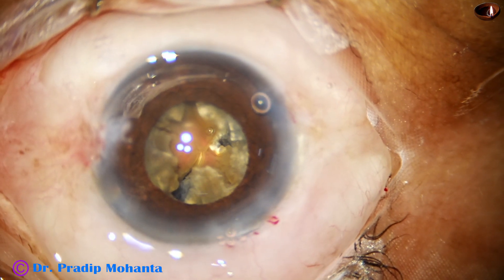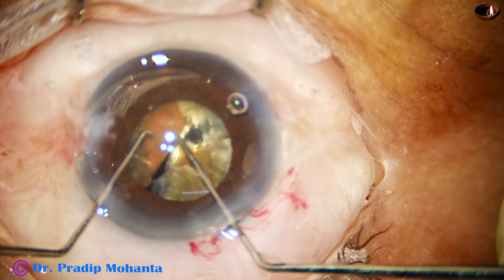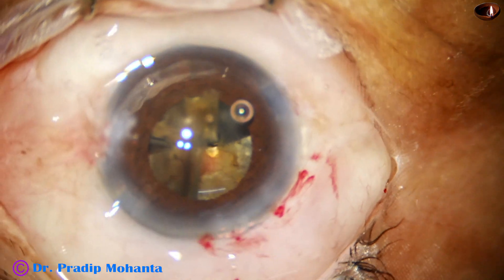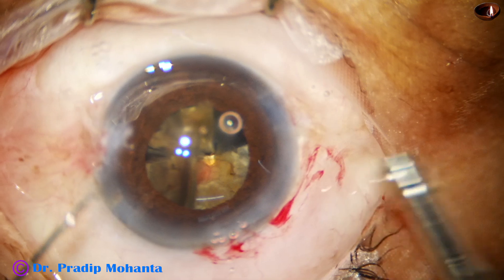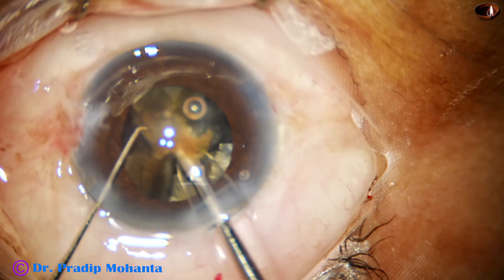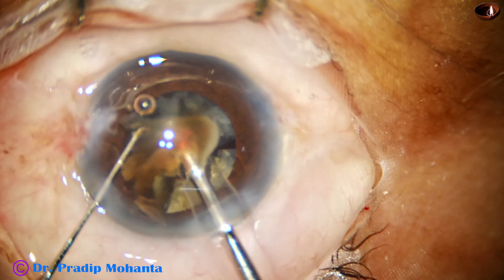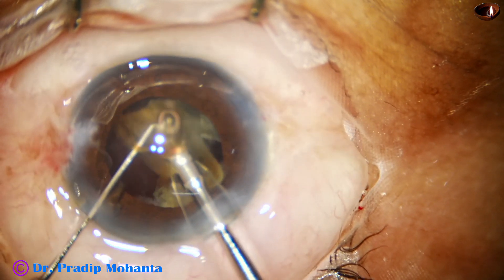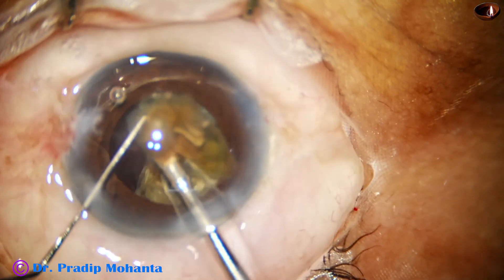There are a lot of leathery fibers and I am not getting the free pieces. I come to the other hemi-nucleus and separate it, separating the two fragments with the hook and then emulsifying these two pieces. Always very slow, always emulsifying at the central part, keeping the tip of the FACO needle at the central part of the anterior chamber at the iris plane.